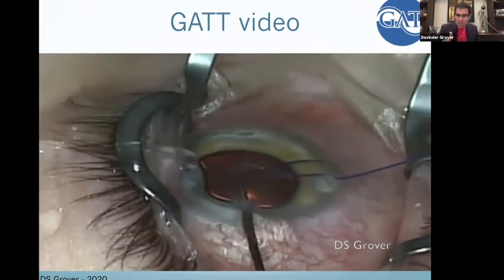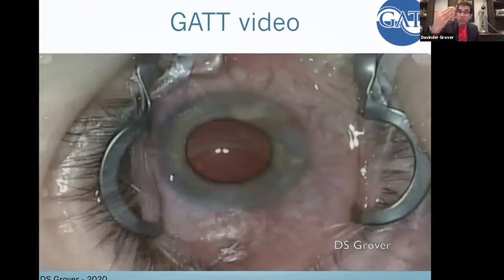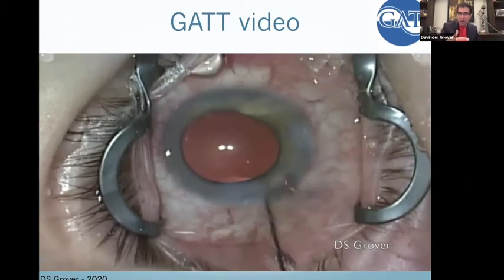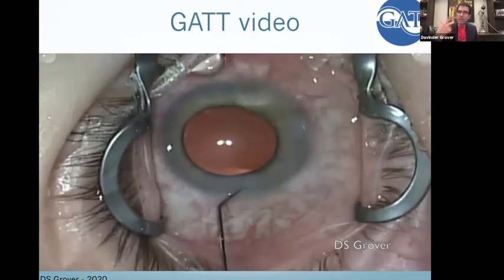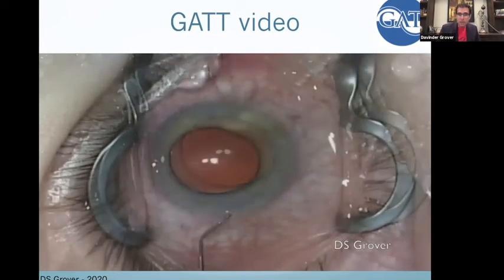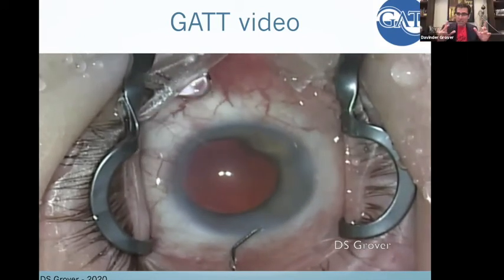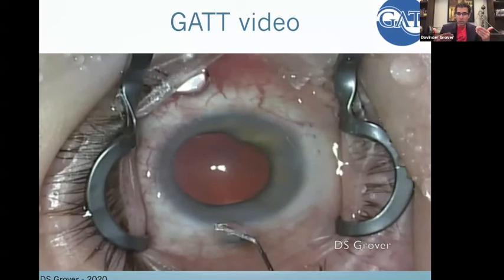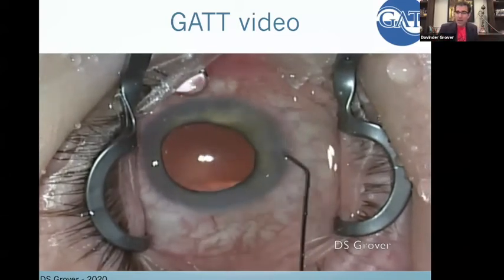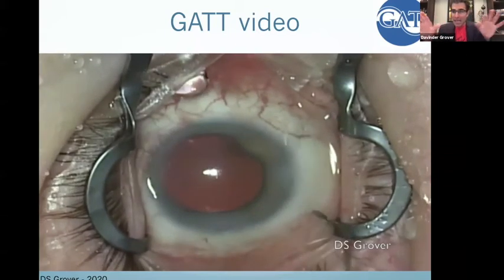And watch this wave. Again, I'm just going to pump up with a cannula. Watch this wave, and the more I do it, the more of a wave I see. So at first I didn't see that great of a wave, but I'm going to keep pumping it, keep pumping it, keep pumping it. And now you see this amazing wave, right? So I think this is diagnostic. It's showing you the outflow system, but I also think there's a therapeutic component that I'm cleaning out and popping open the outflow system and cleaning it out.